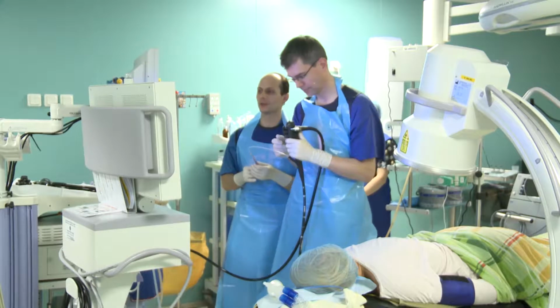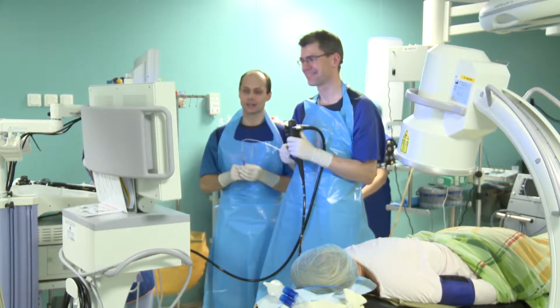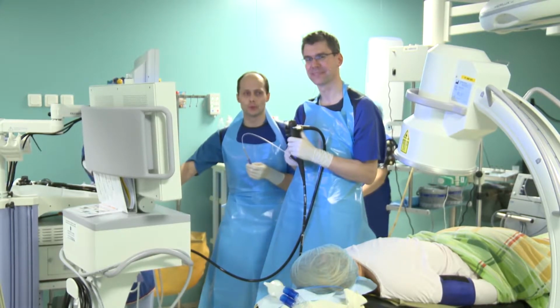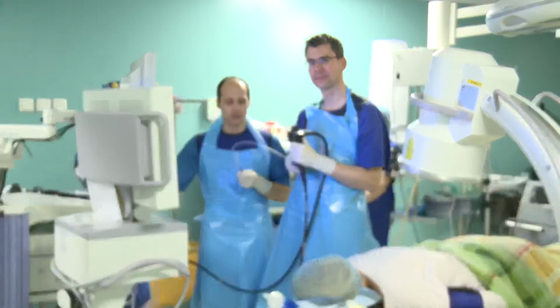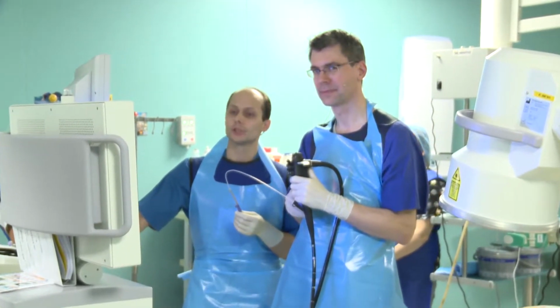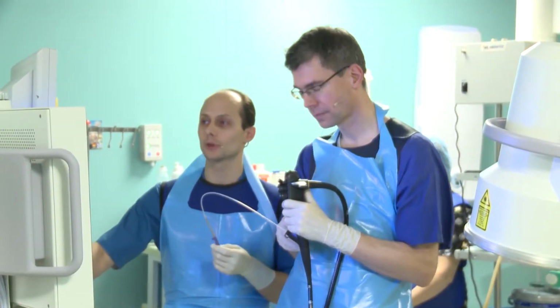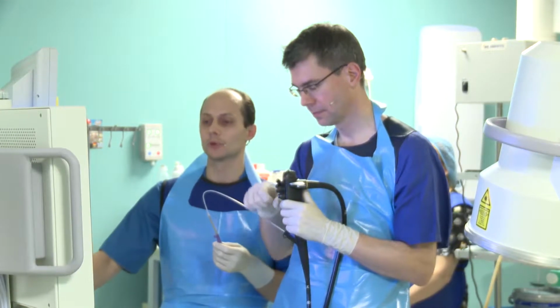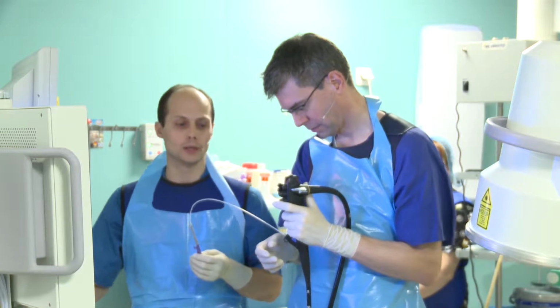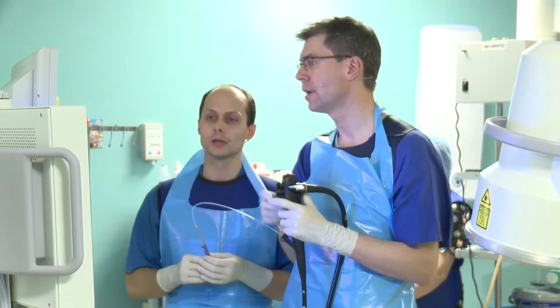Thanks a lot. We can see you and we can hear you. We haven't said anything yet. Thanks a lot, esteemed colleagues. We made this presentation more detailed because it's a very interesting case. Tomorrow we'll have the same or a similar case. So our plan is to do ERCP with possible targeted biopsies, and we'll switch to EUS. We'll try to aspirate the lymph nodes.